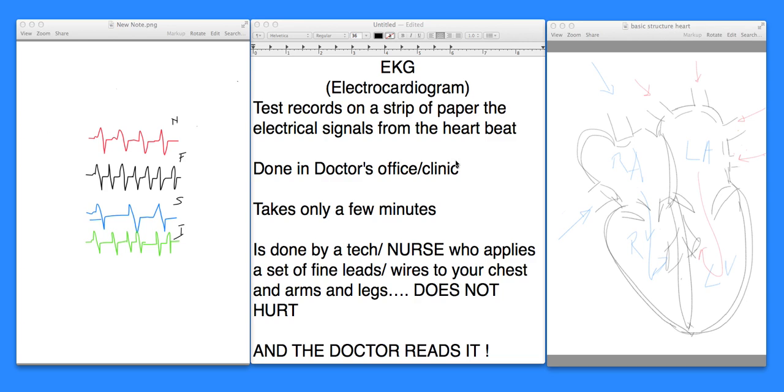If you're a child, the heart may beat very rapidly. It can go up to 110, 120. And it could be normal for an infant. And if you're elderly, obviously, then the heart may be beating slower or sometimes irregular also if there is a disease in the heart. So a lot of the times, just by a simple test on an EKG, the doctor can learn a great deal about how your heart rate and heart pace is, and based on that, further testings can be done, and several things can be ruled out or ruled in depending upon what the doctor is suspecting when you are going and seeing him for various complaints.